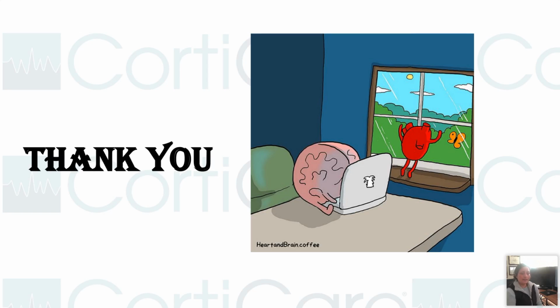Angie's asking, as a tech, what is my role? Well, as a tech, we provide our technical description. We are not going into the details of whether the patient has a poor prognosis. We are not reporting that. We are to report the description of the pattern that we are looking at, how it is evolving, how it is changing over a period of time. Some of you work 4 to 12 hours monitoring.